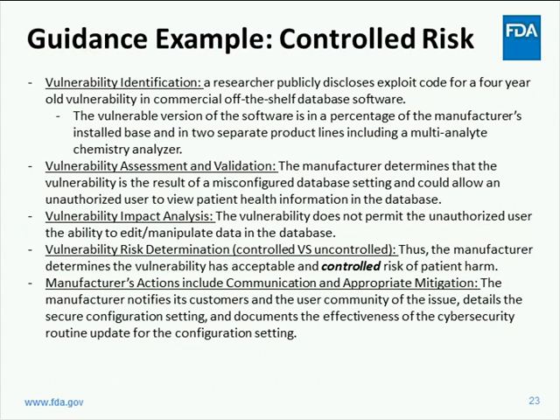In the manufacturer's actions, they communicate and give appropriate mitigations in the communication. The manufacturer notifies its customers and the user community of the issue, details the secure configuration setting, and documents the effectiveness of the cybersecurity routine update for the configuration setting.